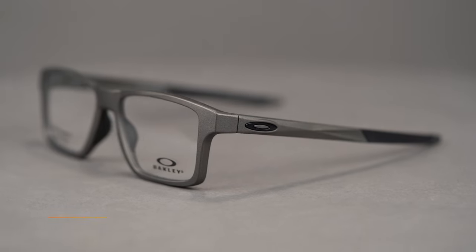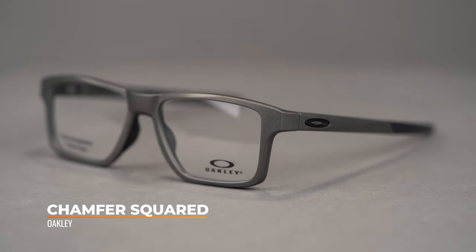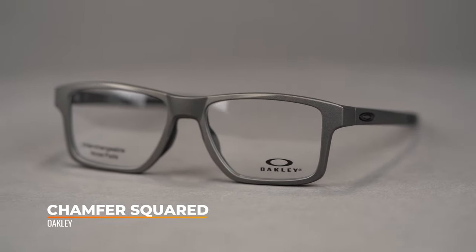Hi there, I'm Tyler, the senior optician here at SportRx, and right now we're going to check out the Oakley Chamfer Squared. Get an on-trend square lens shape with customizable features in this everyday eyeglass.